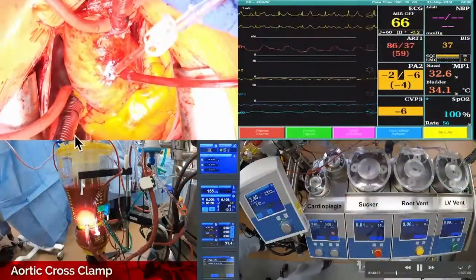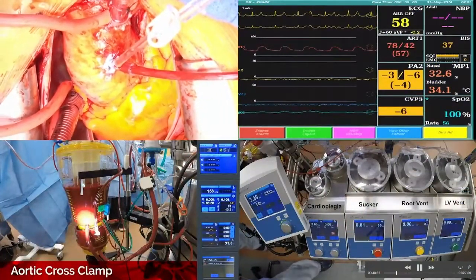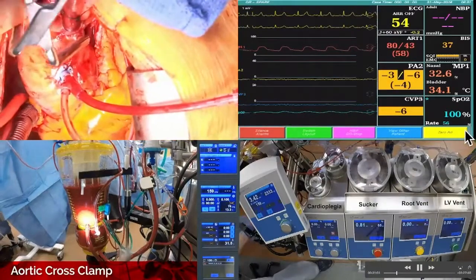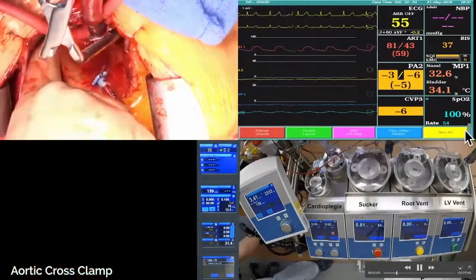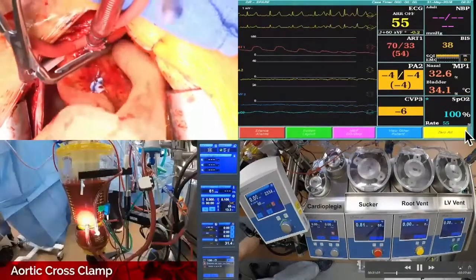You're feeling around. I think you're feeling to find out how deep that aorta goes just before you put the clamp on. I'm making sure, sometimes there's adhesions around there, and you want to make sure you get it all the way across, obviously. And I'm also kind of going on to the underside of the arch. So watch this. You're going to turn the flow down.